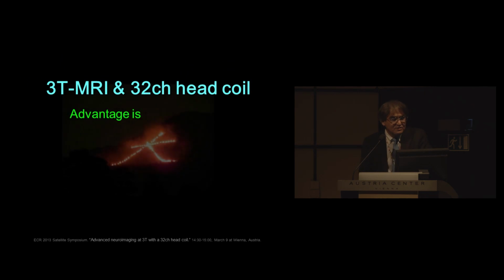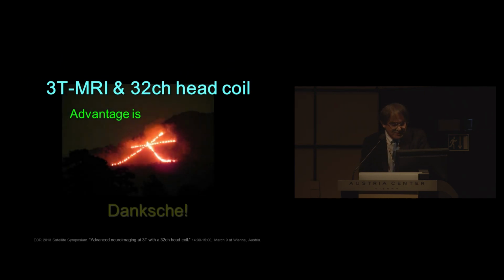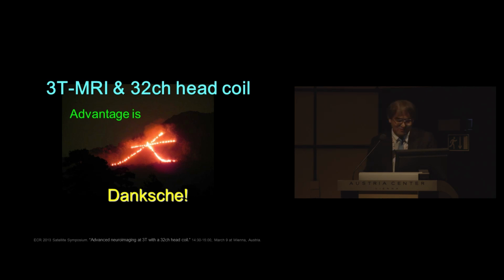Okay, so 3T MRI and the 32-channel head coil. Some people here maybe understand this. The advantage is very large, I think.